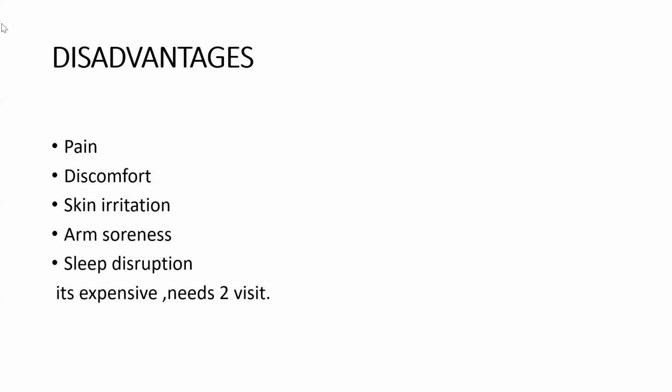And then for patients with latex allergy, I didn't come across what to do if the patient has a latex allergy for the ambulatory BP monitor. Thank you very much for your response.